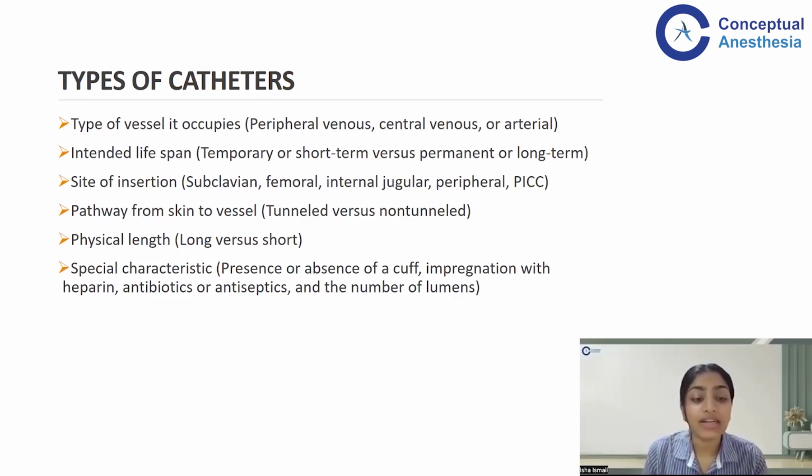And other special characteristics, whether it is heparin impregnated, if it has antibiotics within the lumen itself, the number of lumens that are there, all these will tell you the different types of catheters that are there.